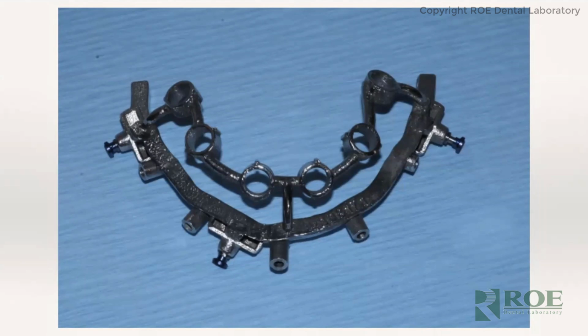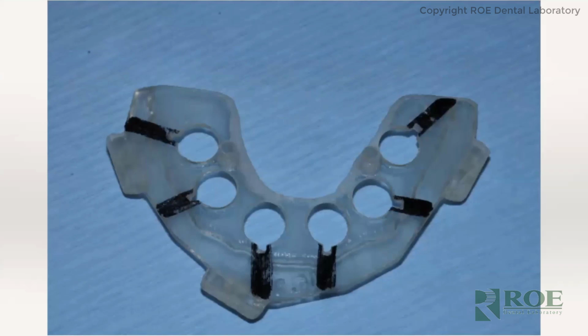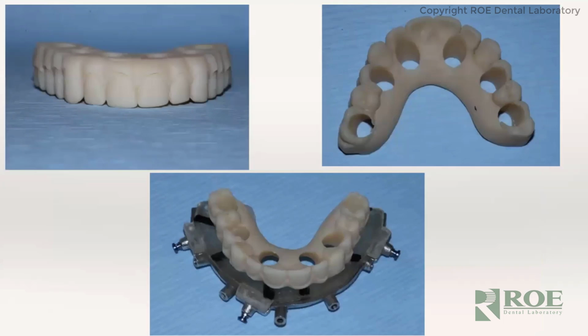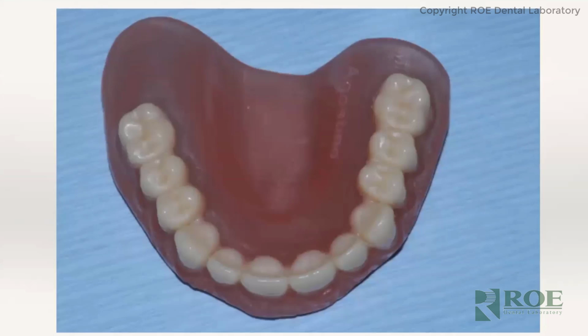Okay, here's our osteotomy guide, making sure that it goes into the bone reduction guide, no problems. Make sure we have nice contact there. We're doing this again with our transfer guide for our PMMA, making sure that fits properly, also for our rapid. And for the final prosthetics, getting everything lined up and making sure everything sits on there nicely with the columns and making sure we don't have any issues. They go over all this and then they'll sterilize this.